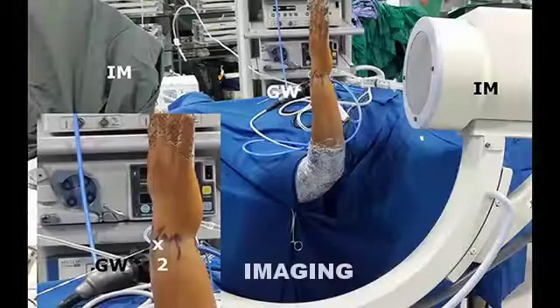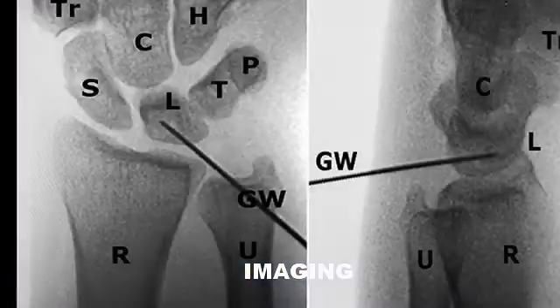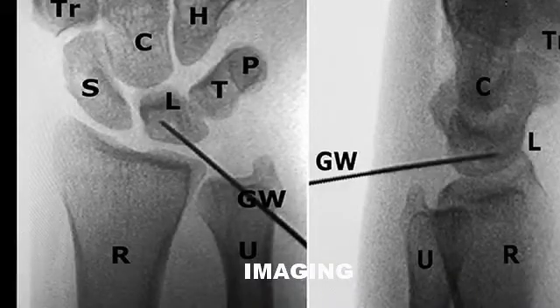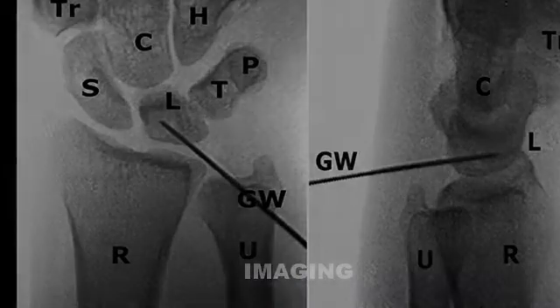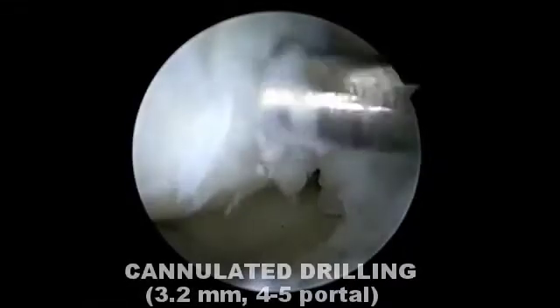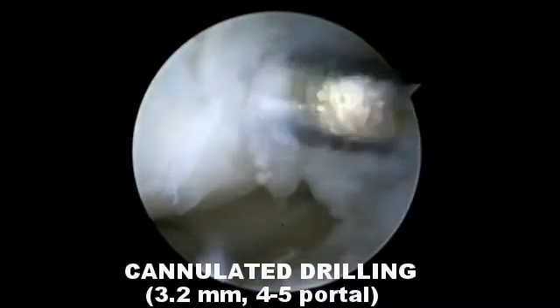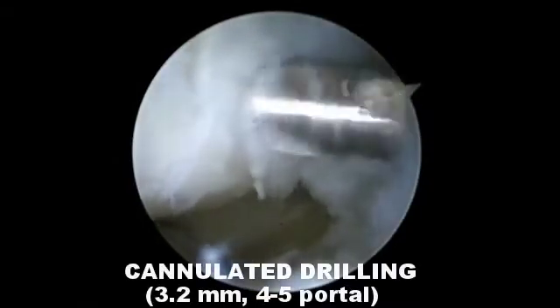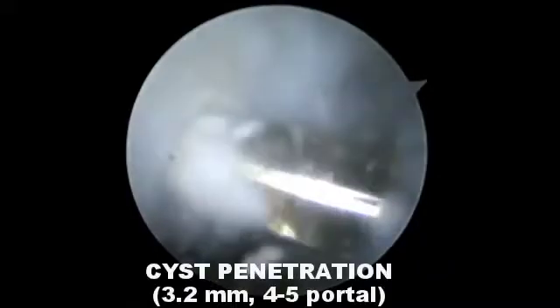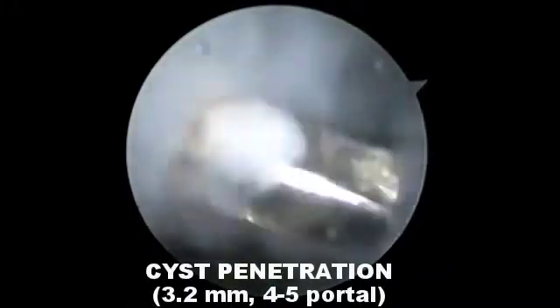An image intensifier is used to confirm the position of the wire in relation to the lunate ganglion. A cannulated drill bit is then used to drill over the guide wire, and cyst penetration is confirmed by release of viscous gelatinous material.